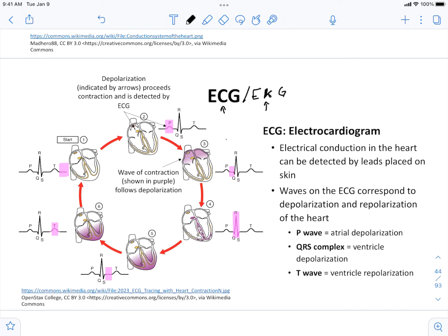ECGs are an electrical recording of the heart, except that we're not really recording it. It's not like we're opening the chest and placing these electrodes into the heart muscle. What we're doing instead is placing electrodes on the surface of the body, and from those electrodes we are reading, in essence, all of the electrical energy being produced. But as the heart is one of the larger and most significant contributors to the changes in the electrical currents in the body, what we actually see is interpreted as the events occurring in the heart.